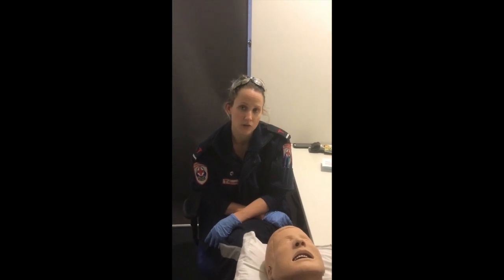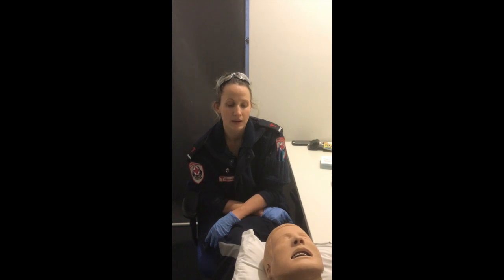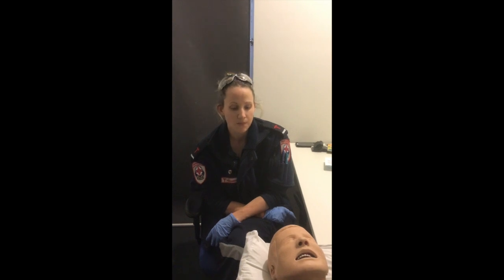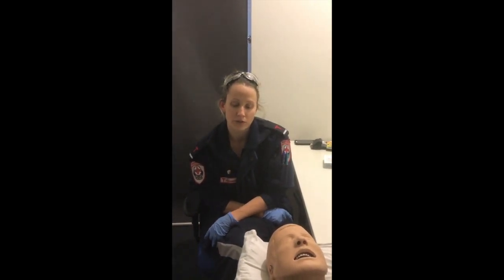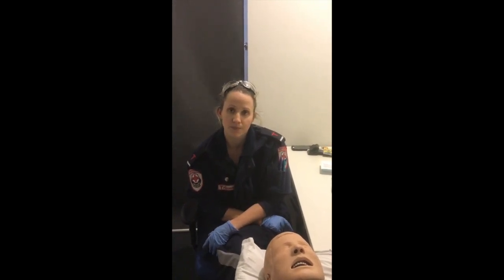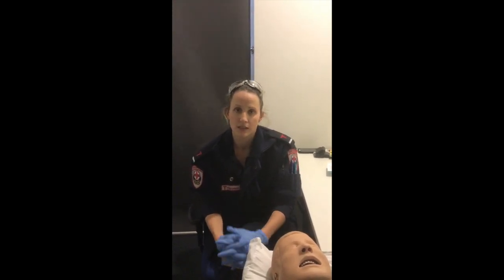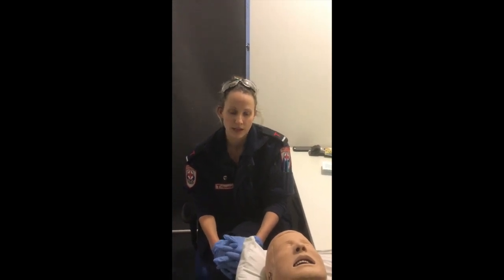So failing your first attempt, when you're starting to identify you could be heading for a difficult airway, some troubleshooting options might be to change and attempt to re-optimize the patient's position, changing the blade size on your laryngoscope or going to a video laryngoscope, going to a smaller endotracheal tube size, changing your introducer, utilising additional operators to assist with the technique.